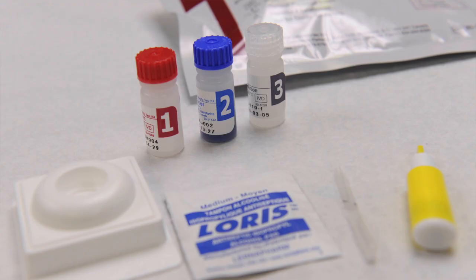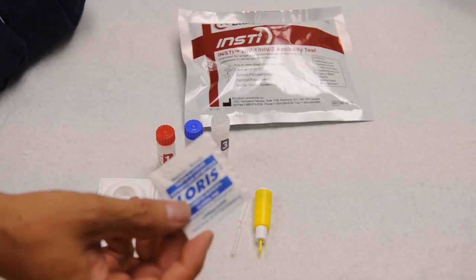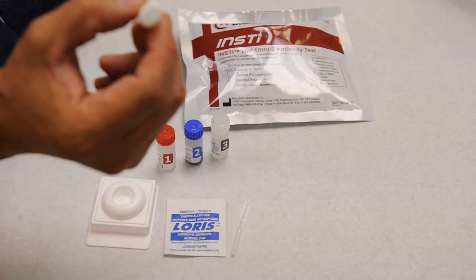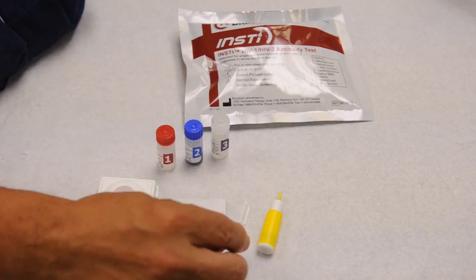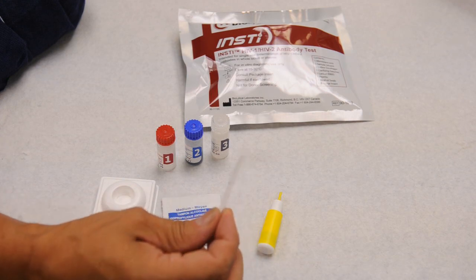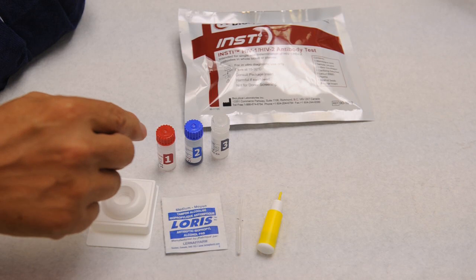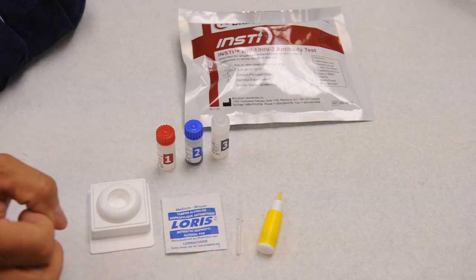The test contains everything required to conduct the test on a subject: the alcohol swab for cleaning the finger at the puncture area, a single-use safety lancet to do the finger stick with, a capillary action pipette to collect the sample, the reagents required to do the test, and the membrane cassette where the test is conducted.